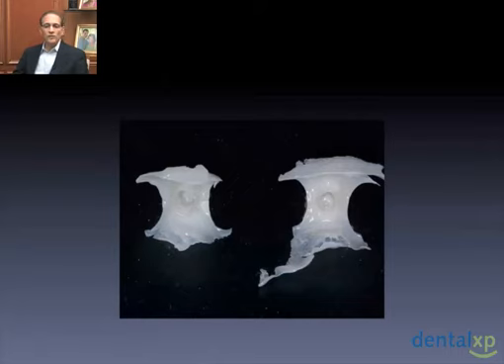Now the beauty is if we turn it over, we can see by expressing some of the material around the neck of the provisional abutment first and then compressing it with the matrix, it actually helps and drives the provisional material subgingivally and will capture much of the subgingival contour. Now naturally it's going to need to be modified, but if we look, we can actually see that we've captured a good portion of that subgingival contour around the provisional abutment.